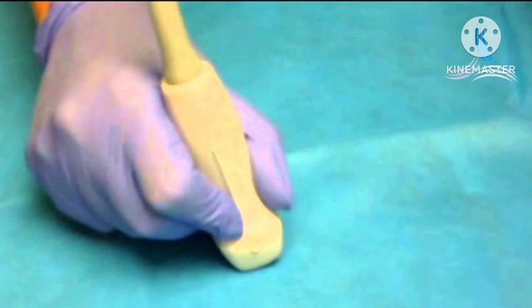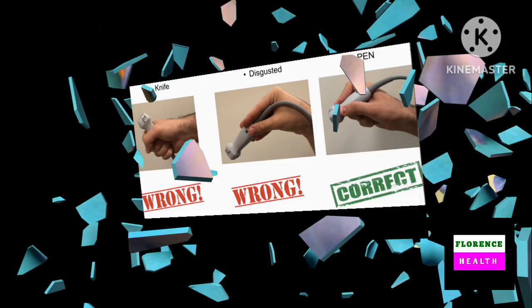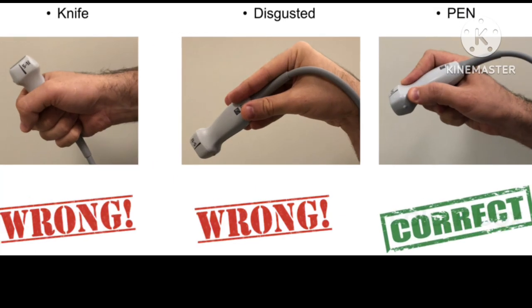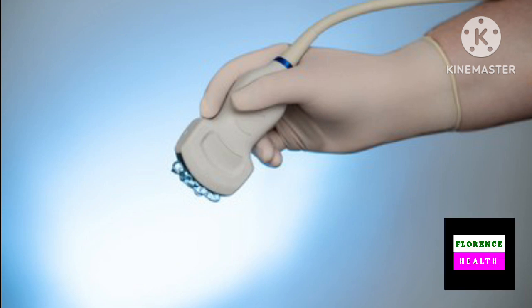See the probe where it is held just like a pen or a pencil. The right side of the slide showing the correct method of holding the transducer. Hold the probe just like a pen or a pencil.